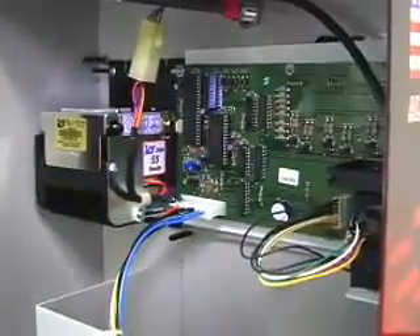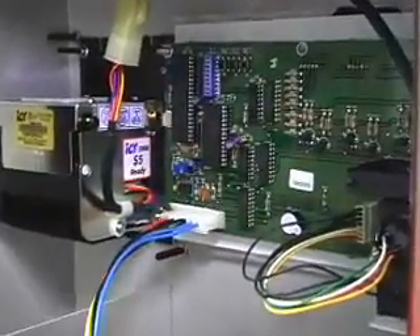Now that the solution is created, I'm going to show you how to put the AlcoBuddy into calibration mode. Let me show you how to do that from inside the machine.